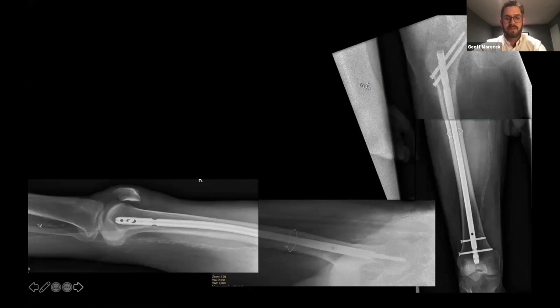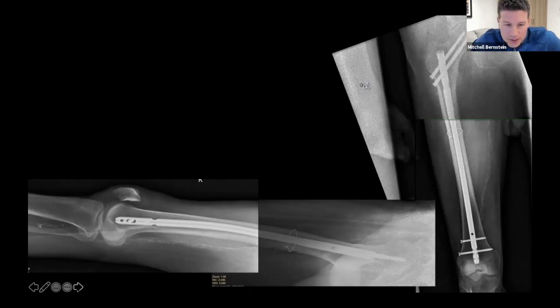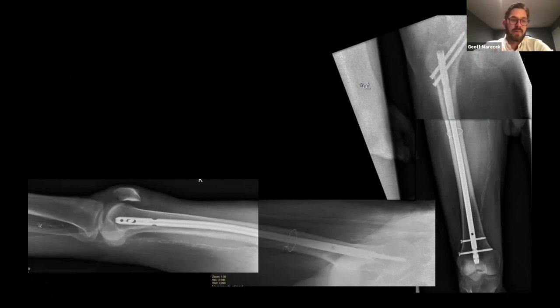I don't know, any comments, Mitch or Ed? Yeah, so one comment, just for thought, is hoop stress and being slightly anterior. We don't necessarily have time to discuss it, but being collinear with the canal in the piriformis fossa and moving just anterior to it, it should increase the risk of iatrogenic femoral neck fracture. Was that fair to say, Jeff, or not necessarily? That's what we would extrapolate from old nailing. I would argue that in modern nailing, we don't have any reports of that.